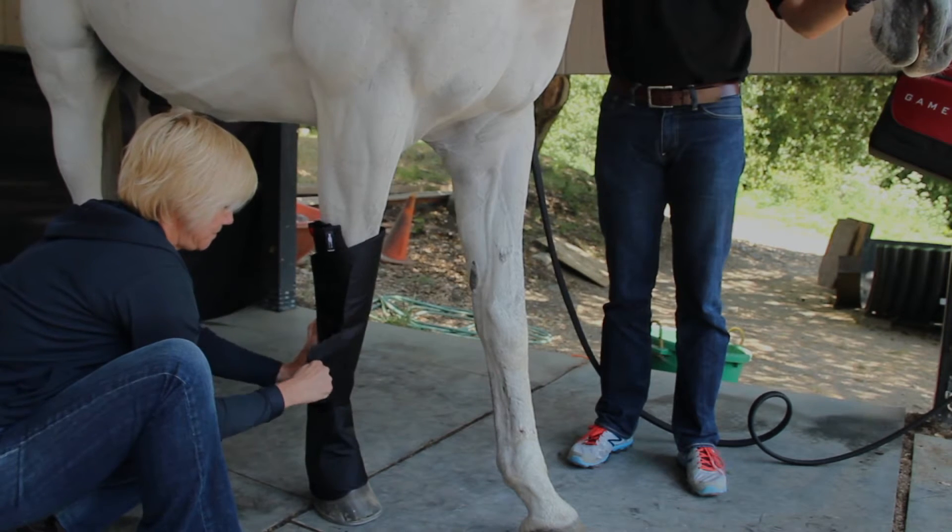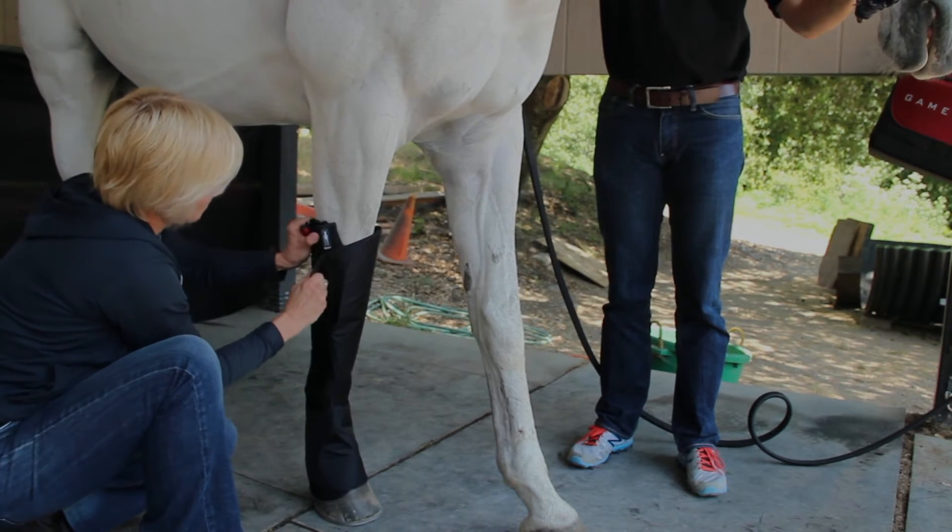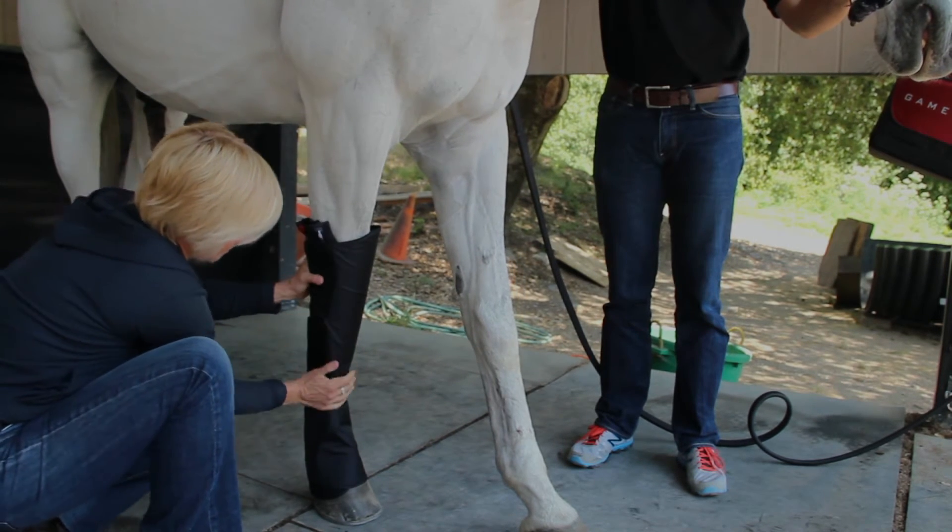From the top of the knee down to the hoof in front, or from the base of the hock down to the hoof.